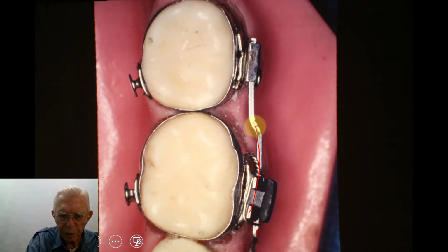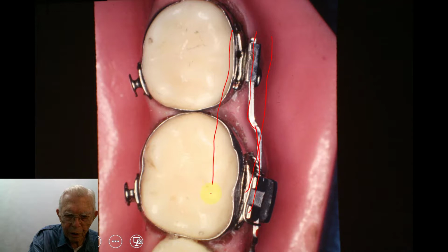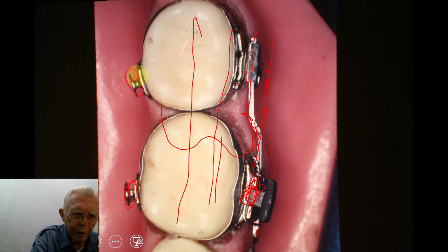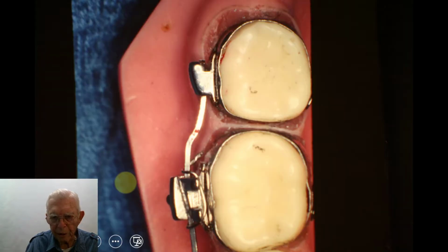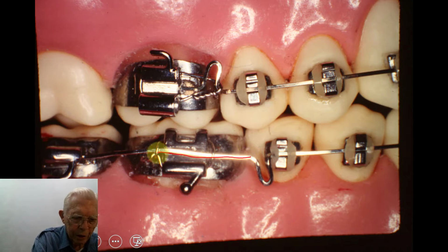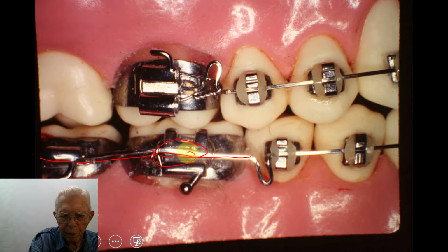Now here, if we're coming through and this would go on out this way, so we put the wire over to the side. Now we got the incisal edges of these teeth, and the upper molar tooth fits into there, kind of like that. And that lines these teeth up, so we have to vary this. But when you make a bend here, you've got to convert this bracket right here. Now on the bottom we put little buttons, and sometimes we'll put these O-rings on them to keep from rubbing and irritating the tongue when we use them. That's the other side of the mouth now. And there is like you're going up with this one, and then you go down and go in here. So we have to make a couple of bends in this, and then we ligature this part in the wire.